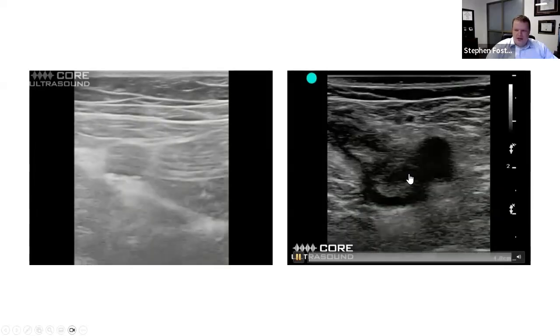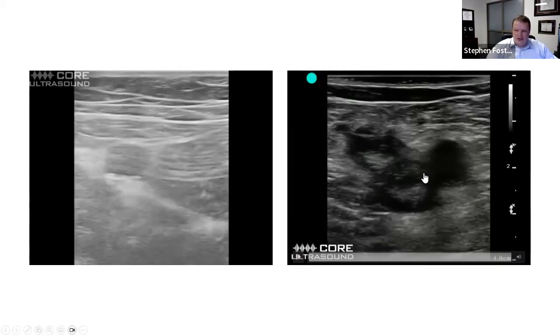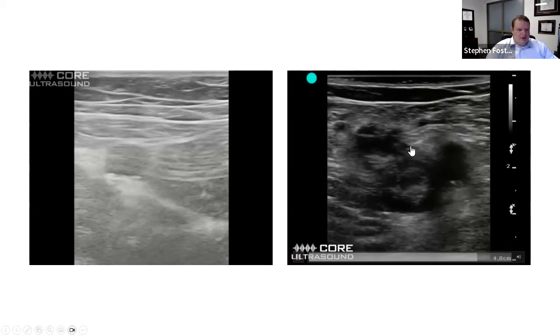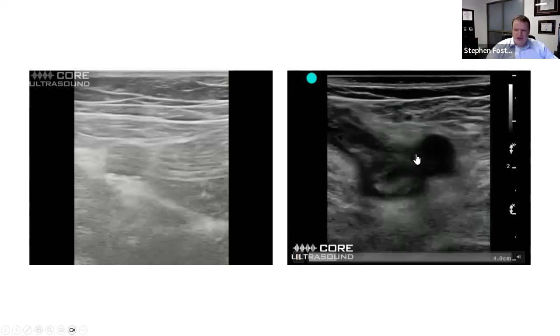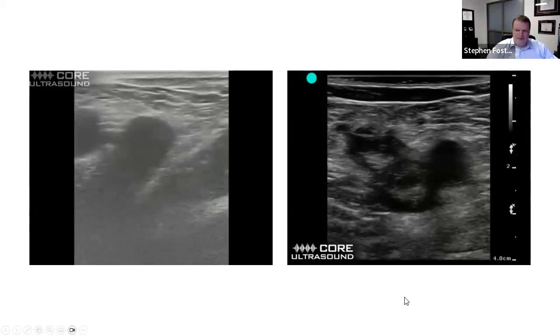On the other hand over here, we have the artery that's pulsatile right here, and if you notice, this vein does not close all the way down, and there's some echogenic or abnormal colors inside of the vein itself. If you start seeing this, this is what a blood clot will look like. You can actually put flow on it, which will show if there's blood flow around it, kind of showing that there's blood there, but it's stopped or it's traveling in the wrong direction. And so what you'll do is you'll find this, you'll scan up and down, and this will kind of imply that there's a blood clot there.